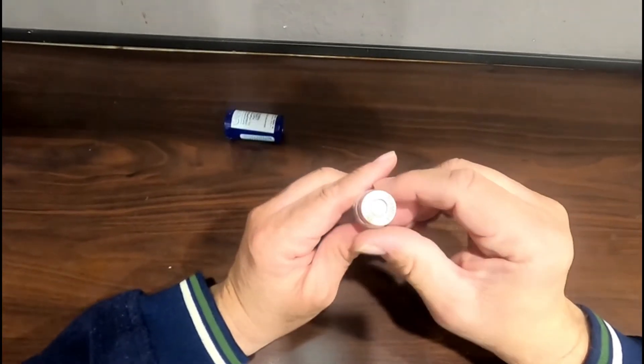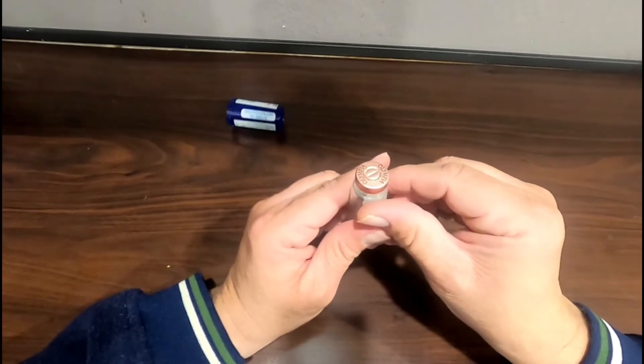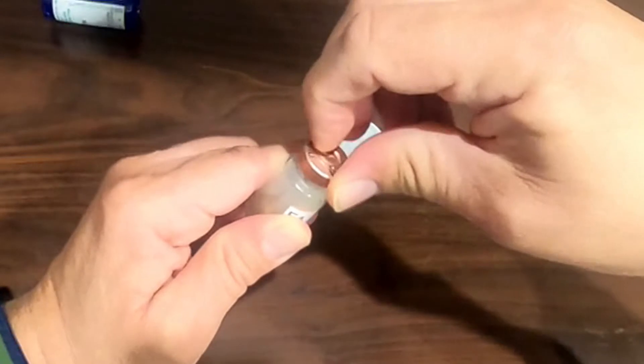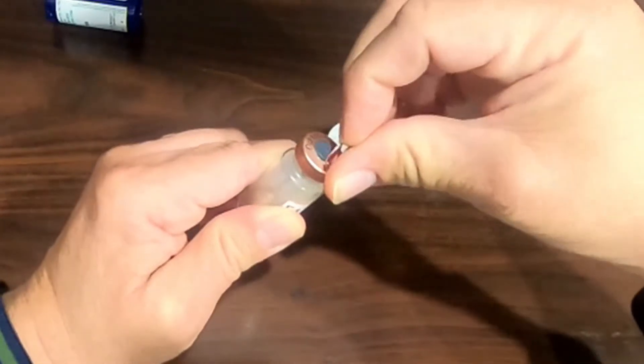If this is the first time that you're using your medication, you'll need to remove the metal cap from the top of the vial. Place your fingernail underneath the top and remove the cap.